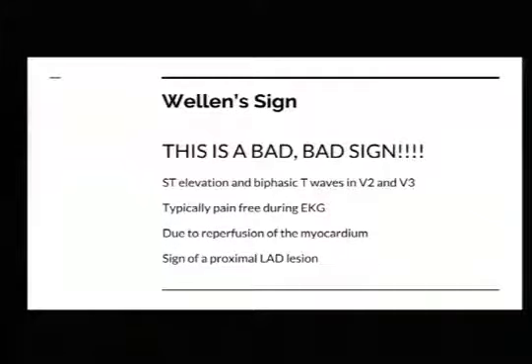So, again, the reason to show us and make sure we see those kind of unusual, bad-looking pre-hospital EKGs, because we may not see that by the time you get them to us. And that's why a lot of these get missed, because they are pain-free by the time they get to the ER, whether they came in by pre-hospital or came in the front door. We get a 12 lead and they look good. And then they'll go on and have another event 2 days later and have a cardiac arrest.